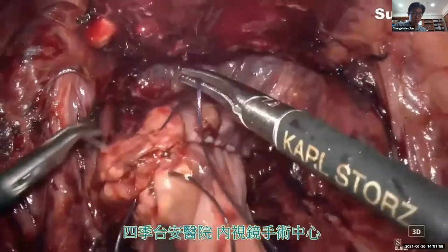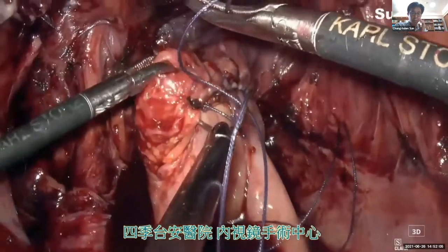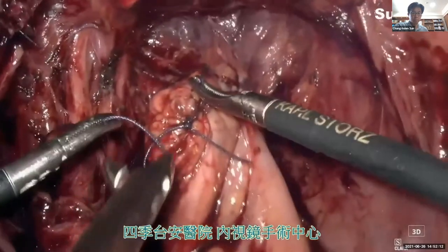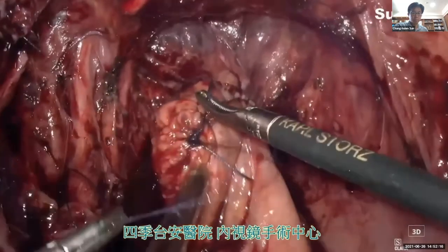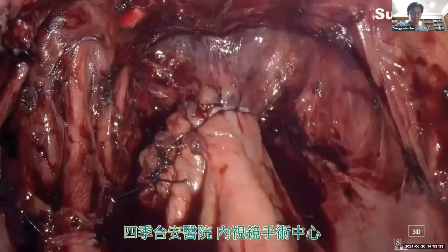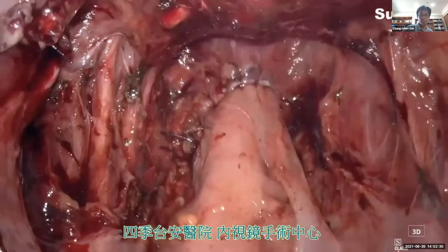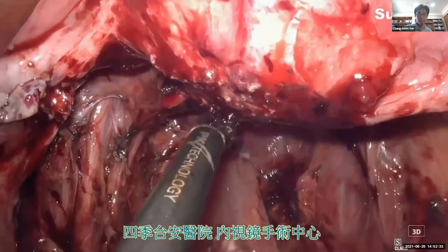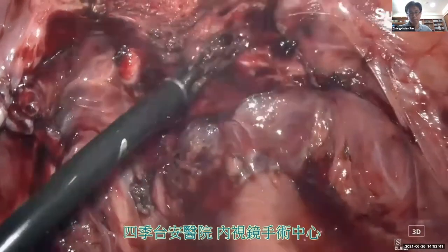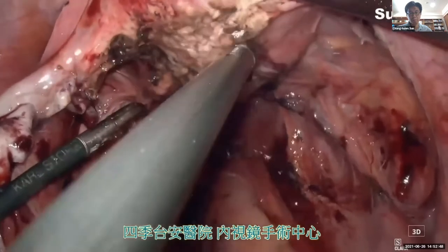Okay, we are now going to finish the muscular defect reapproximation. Now we are using bipolar energy to make hemostasis and to disrupt the potential residual DIE lesions over the posterior uterine wall.